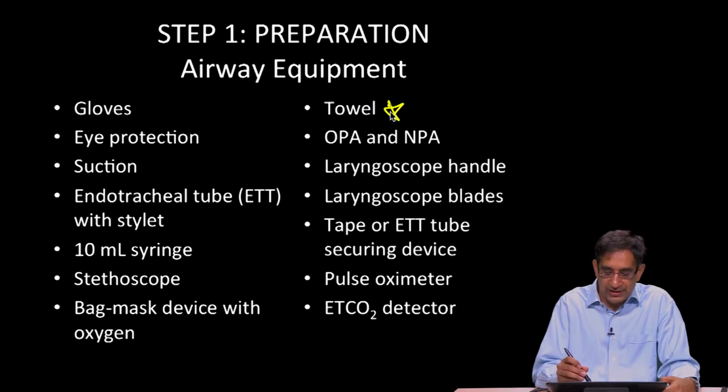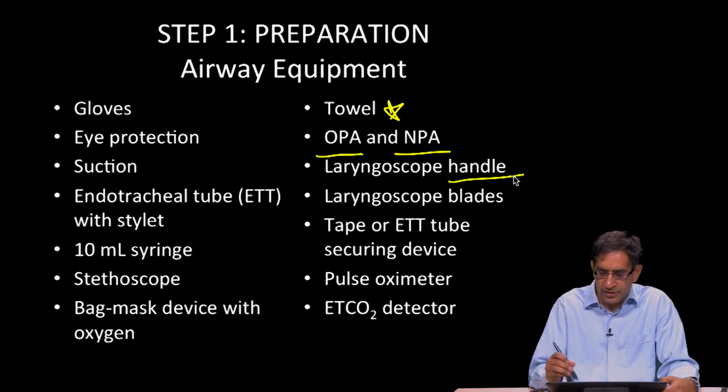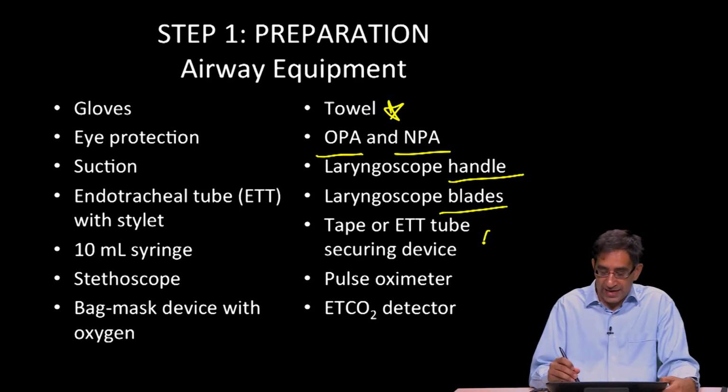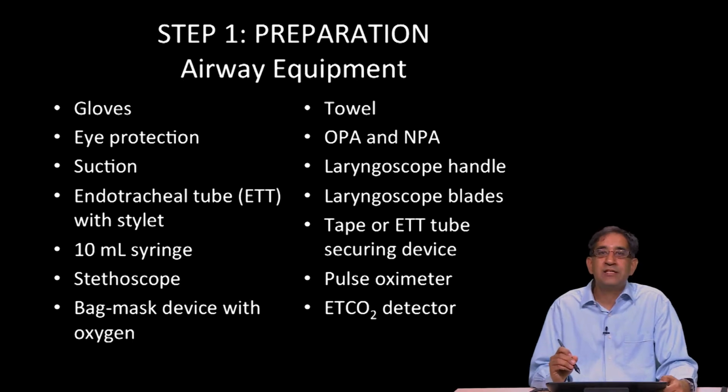In addition, as you'll see, a towel can help align the patient's axes and give you better visualization of the vocal cords. So a towel should be available either to place underneath the patient's head or in some circumstances underneath the patient's shoulders. You want to have an oropharyngeal and a nasopharyngeal airway available in case you need to ventilate the patient. A laryngoscope handle appropriately sized, a laryngoscope blade, either a straight or curved blade. You want to have tape available so that you can tape or secure the endotracheal tube. And then again, we talked about monitoring devices or monitoring equipment. You certainly want to have a pulse oximeter and an end-tidal CO2 detector or end-tidal carbon dioxide detector available. So this is a list of all the equipment that you want to have available every time you intubate somebody.